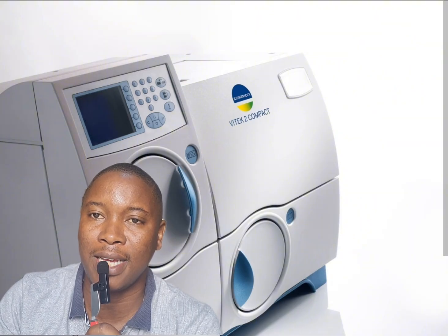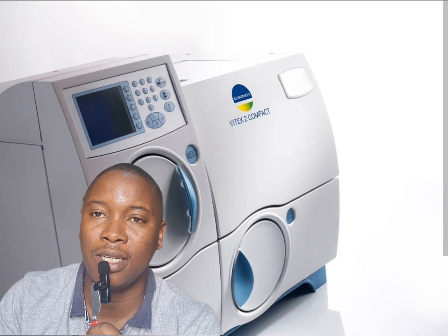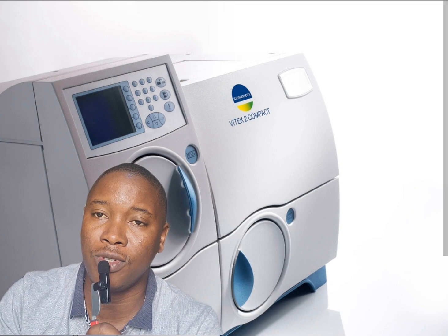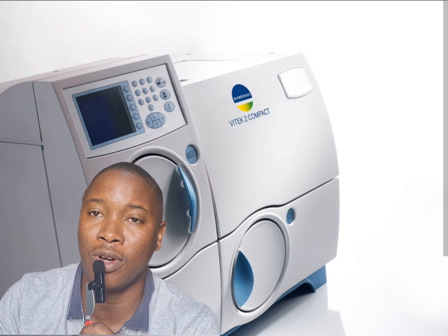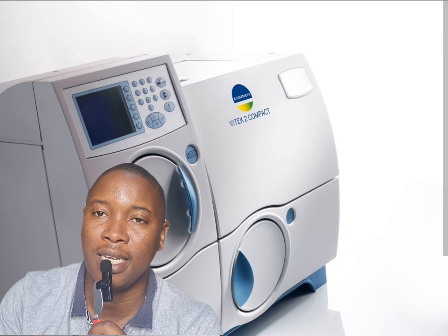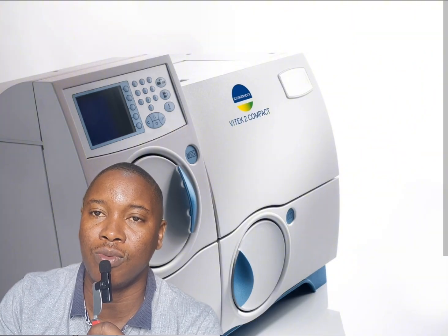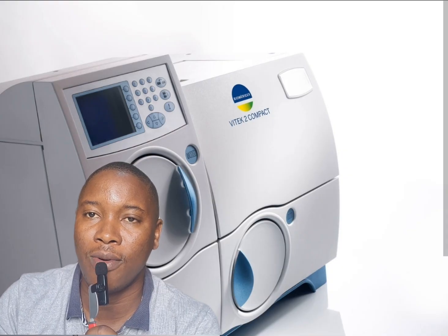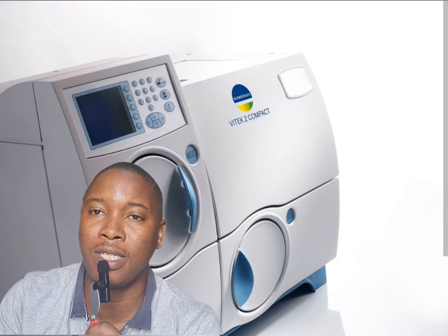Now, this Vitek machine carries ID cards, and what you need to do is you have your media, and the media is usually in the form of a broth, and then you culture your microorganisms in this media, and then you adjust them to a 0.5 McFarland standard. It's a standard for turbidity. It's a way to measure your microorganisms to make sure that you are taking the right amount of microorganisms.